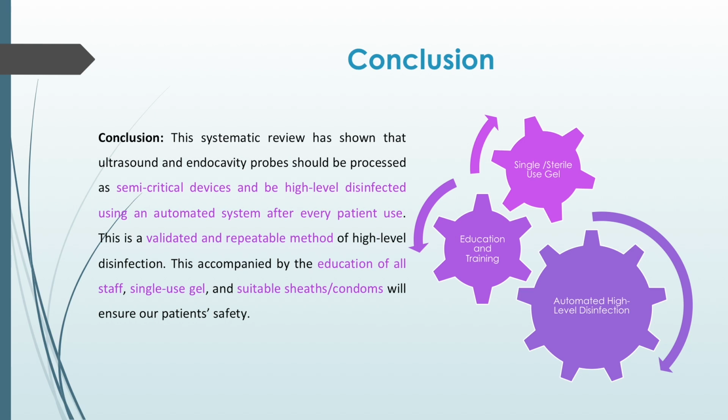So what did I learn from my research, and how will it help me going forward and help my patients? I started with the question, what is the impact of automated high-level disinfection on microbial colonization in ultrasound and endocavity probes? The findings suggest that while some departments and countries do follow automated high-level disinfection for ultrasound probes, there is also a wide range of other disinfection being performed or not.